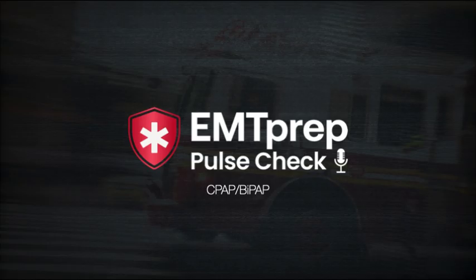So what settings would we like to start on CPAP with? When we get our patient in the back, our partner's starting to set up CPAP. Maybe we're coming up, or maybe we're setting up epi, IM. Maybe we're just going to put on CPAP and see how we do. But we can all tell from this patient, it seems like she's got a kind of a mixture of hypoxemic as well as hypercapnic respiratory failure. So in this scenario, we started with CPAP, and we want to start with that 5 centimeters of water. And we'll place her on CPAP, and we'll see how she does for a little bit.